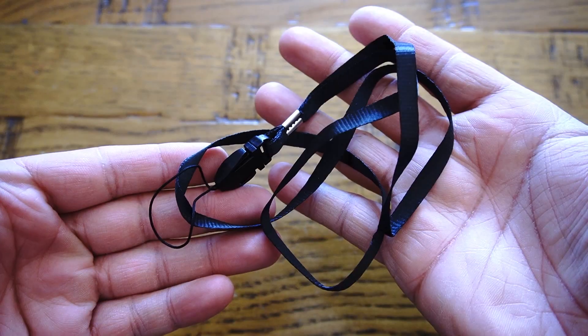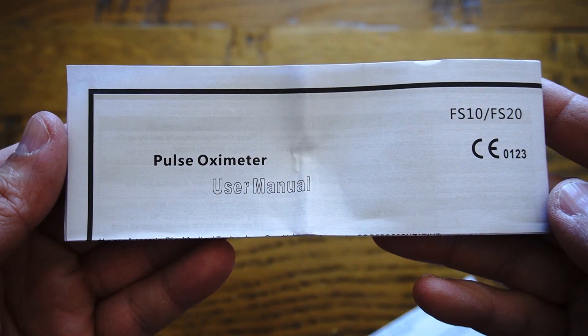Within the packaging you get one pulse oximeter, one lanyard, and a user manual.